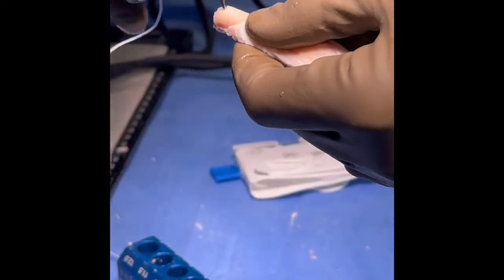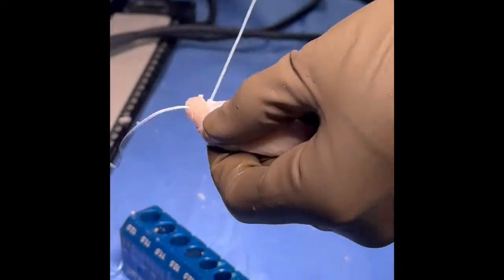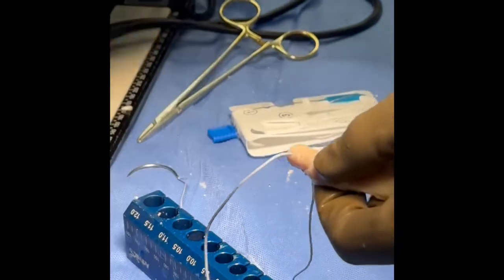We then pass non-absorbable suture through the two tibial drill holes.